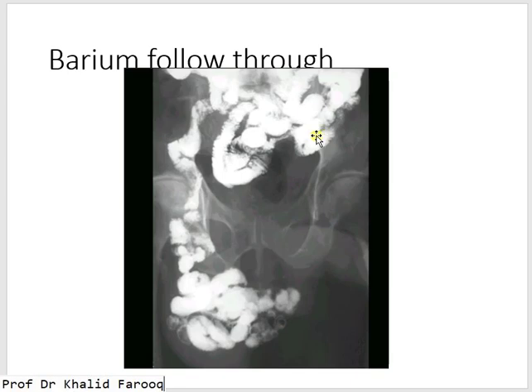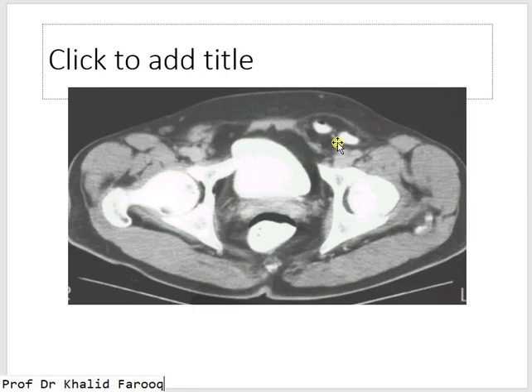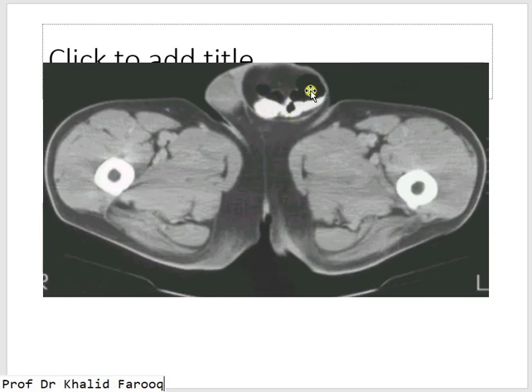On barium follow-through examination, small bowel loops are herniated through the inguinal region into the scrotal sac — inguinal scrotal hernia leading to intestinal obstruction. Hernia can also lead to intestinal obstruction. On CT examination of the pelvis, contrast outlines the urinary bladder and large bowel, and contrast-filled small bowel loops are seen in the inguinal canal on the left side. The same patient shows small bowel loops containing air and contrast with mesentery in the scrotal sac.